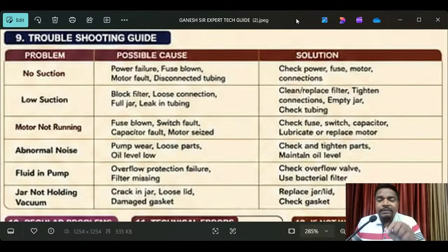As for biomedical engineering, I come from a completely biomedical background, with 18 years of experience successfully completed. Let me continue. Now today I bring for you all the aspirator suction machine, a biomedical engineering equipment. I'm going to explain it right now.